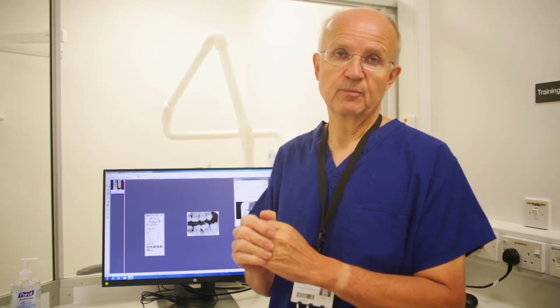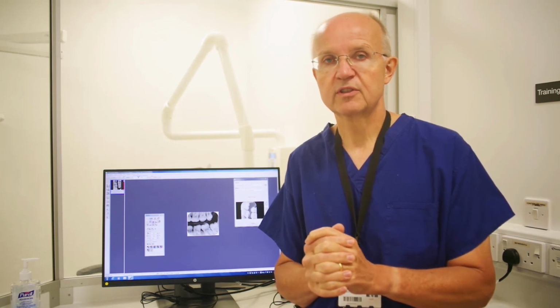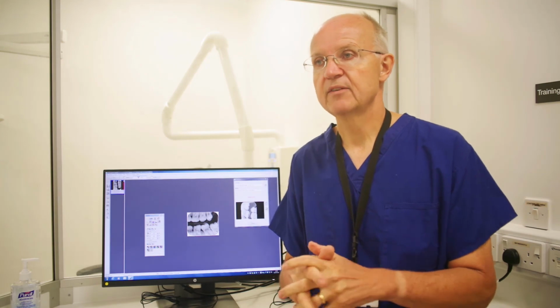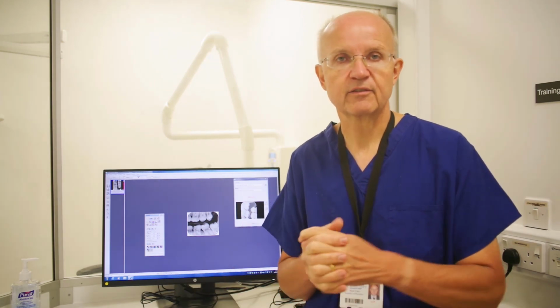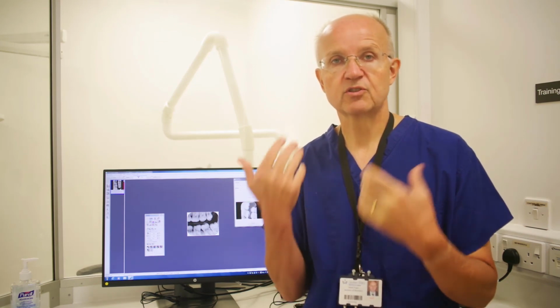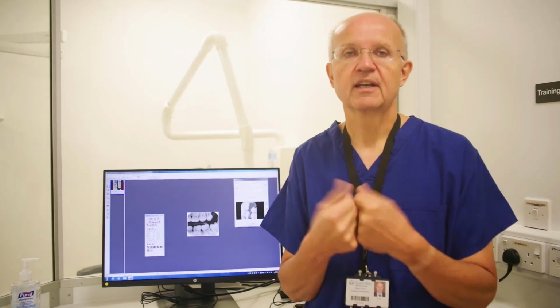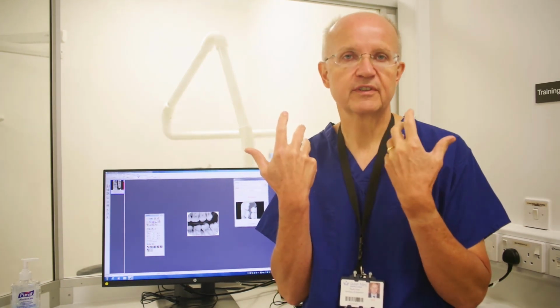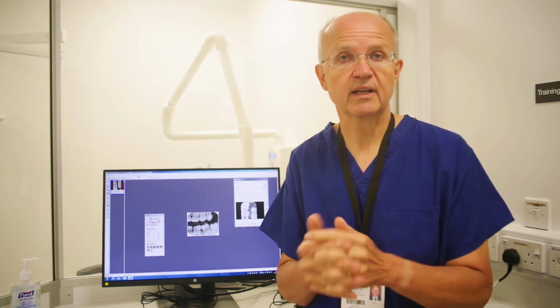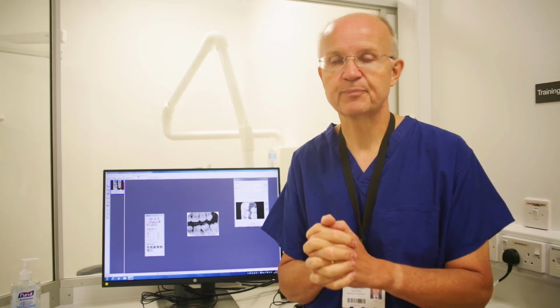So we're going to be doing that with you when you come to radiology next term, and you'll certainly get a chance to take some radiographs on Dexter, and depending on the coronavirus rules and things at the time, we would also get you to position the holders on each other, so you get to feel what it's like to be a patient, and you can feel how those holders feel within the mouth, so that you appreciate why you need to be quick, and how to best position them so that it causes minimum discomfort.